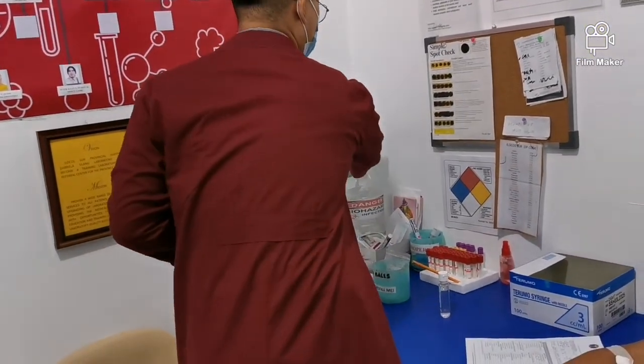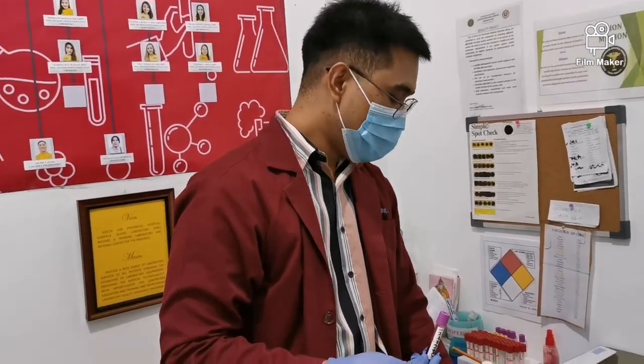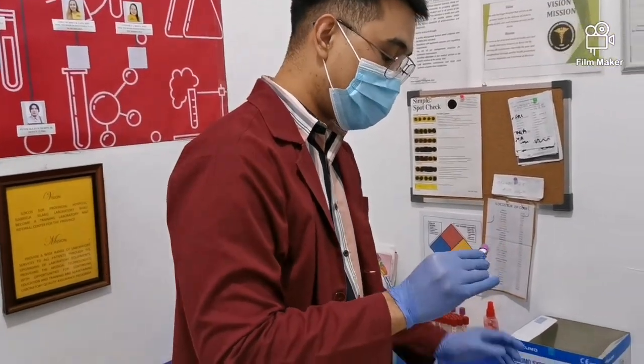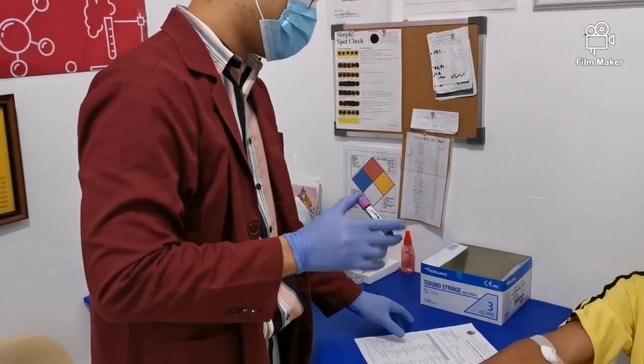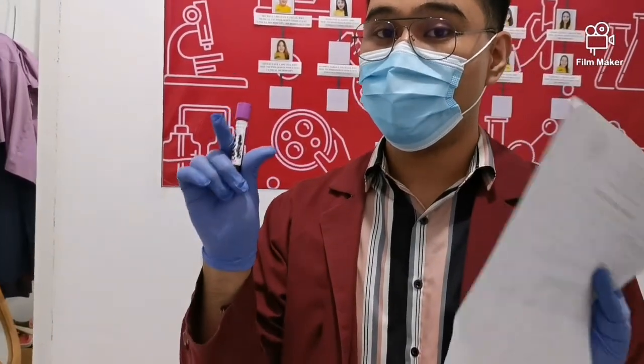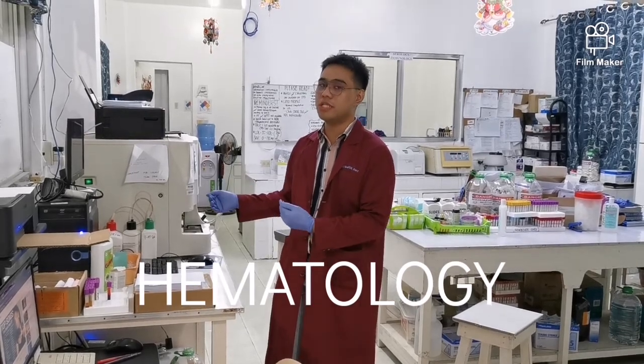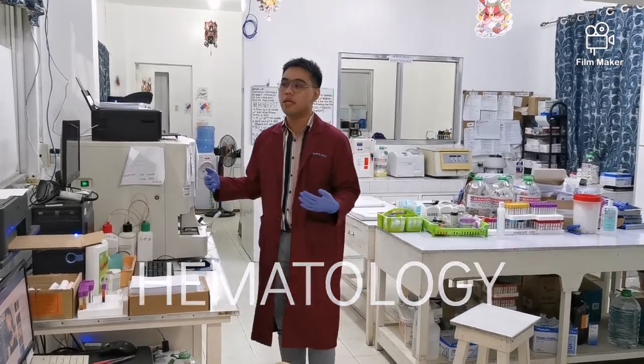So ayun, you now dismiss the patient properly and instruct them what to do later on. So ayun sir, balik na lang po kayo after 30 minutes to 1 hour. Ayun sir. And ito na, it will go to our hematology section. So dito sa hospital na to, sa laboratory nito, ang pinakaunang makikita mong section ay yung hematology. This is the hematology section, okay?